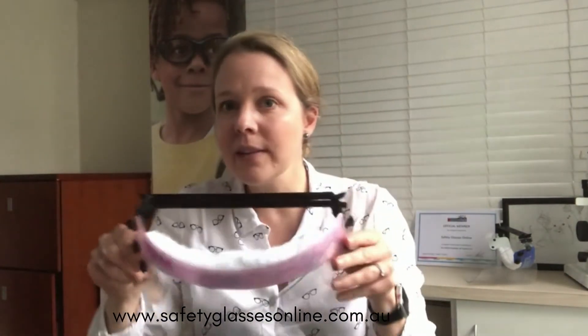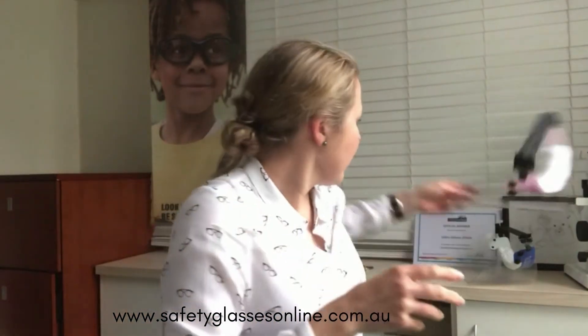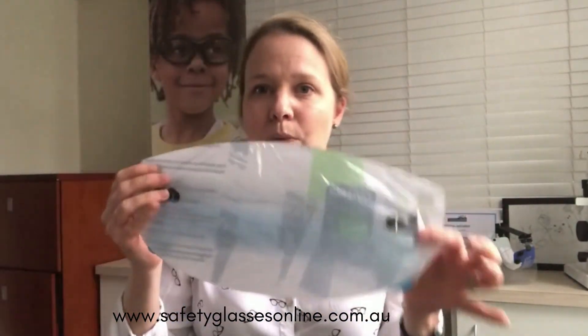It's also still got that gap between the cushioned headband, and you can get extra ones of these so while they're in the wash you can use the other ones — that's always handy. There is another version which is even smaller, made for children, so if you're worried about your kids' safety, they are available. Thanks.